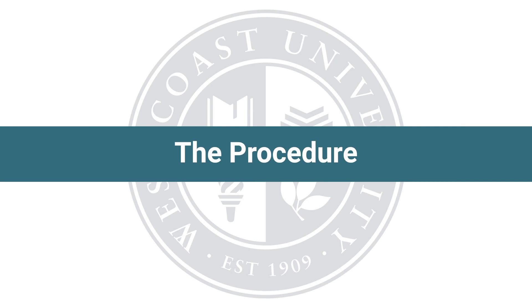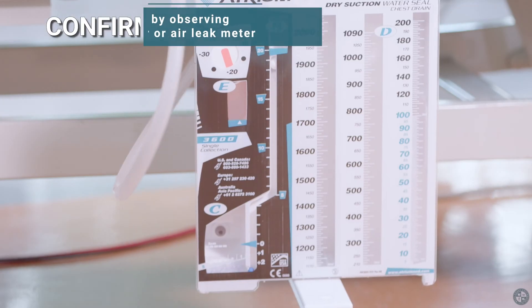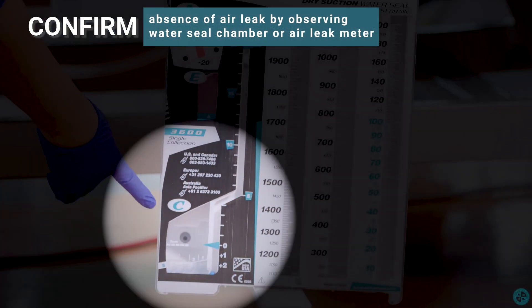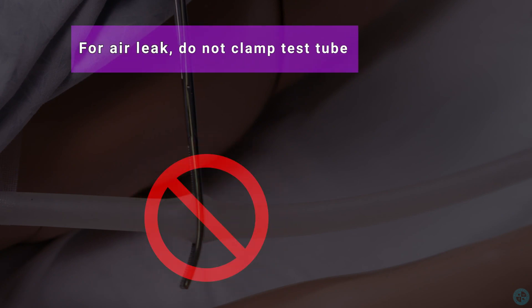The procedure. Confirm absence of air leak by observing water seal chamber or air leak meter. For air leak, do not clamp chest tube.